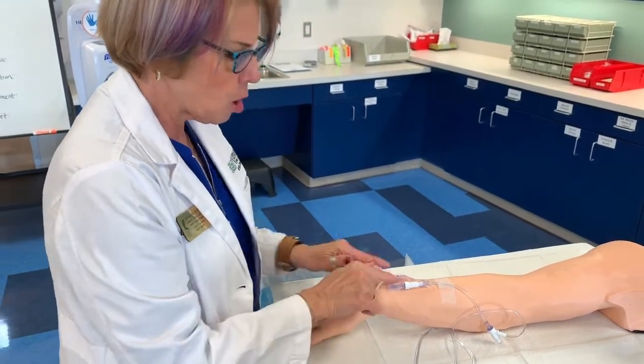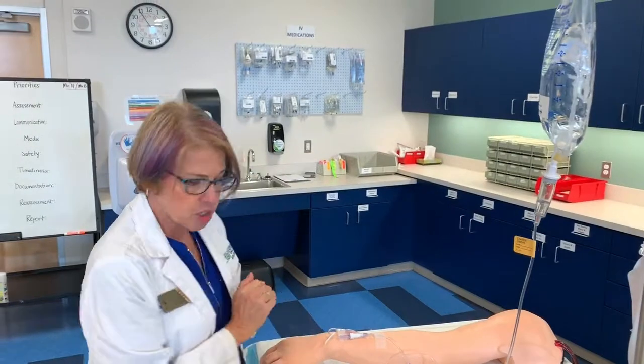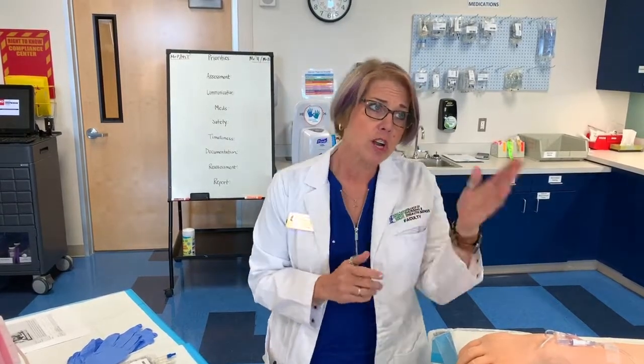I've got my clamp open. I've got my fluids running at the prescribed rate. I've double checked that my patient is comfortable. And then before you leave the room, I always like to check, is there anything else that the patient needs before I go? I like to perform hand hygiene, and then we can go off along our day. So there you go, starting IV fluids with primary tubing without a pump.